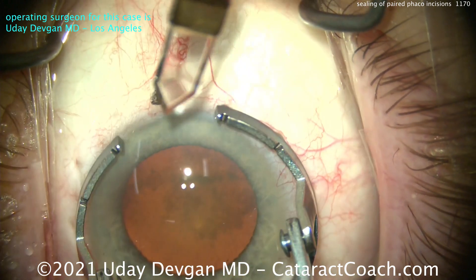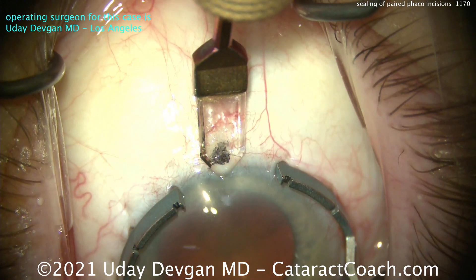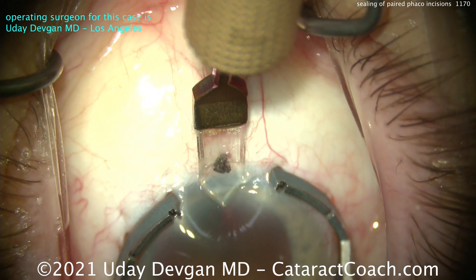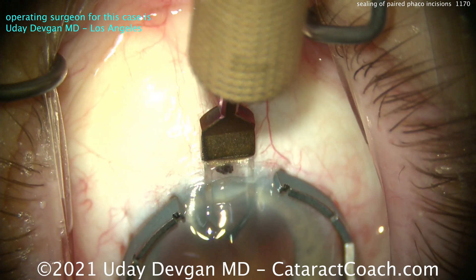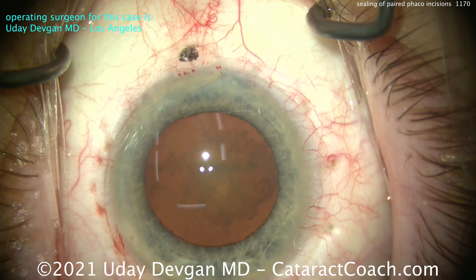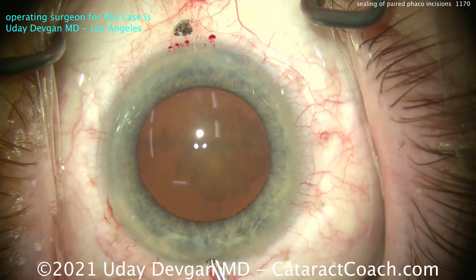We're going to make it beautifully. Both incisions are essentially identical, using the same instrument, the same technique, the same architecture. And here comes that nasal incision. This incision is purely for treatment of astigmatism — in this case about 0.75 diopters. So there are the two phaco incisions. You can see it's a real cataract.